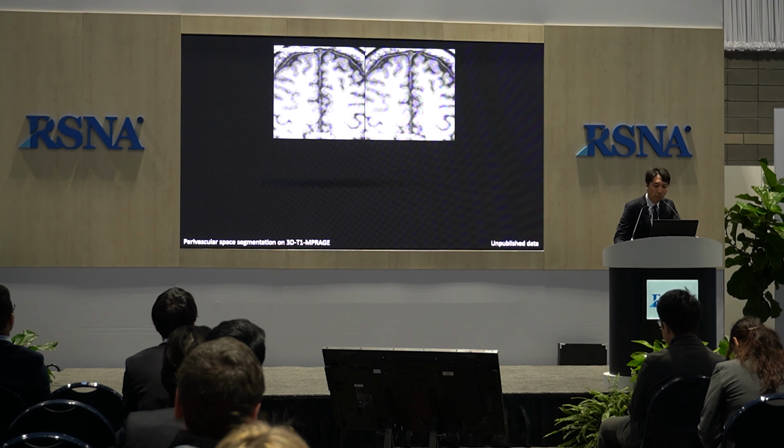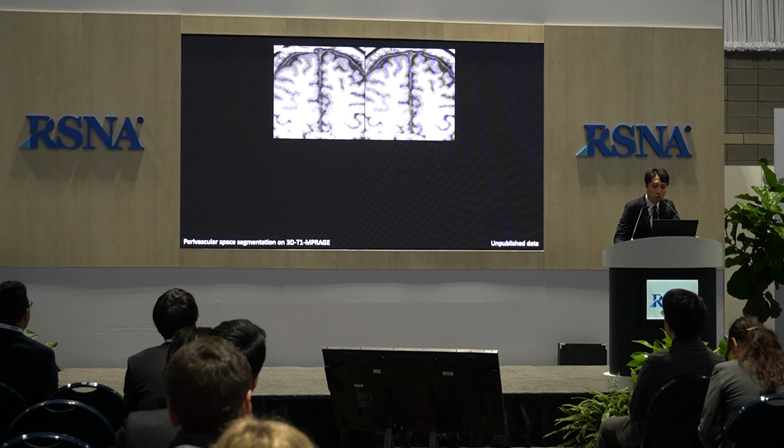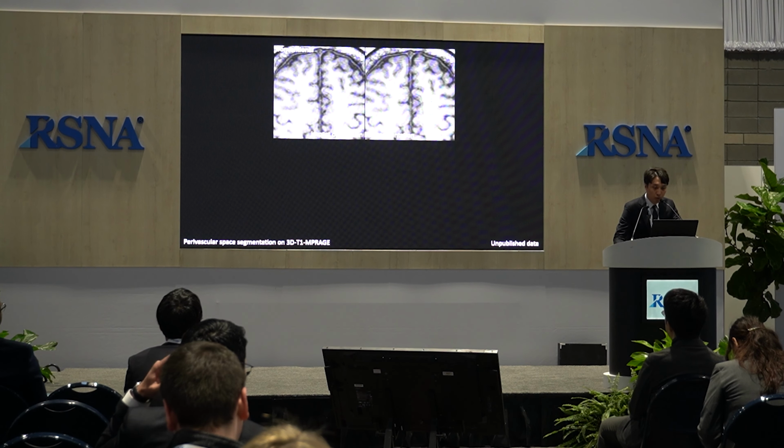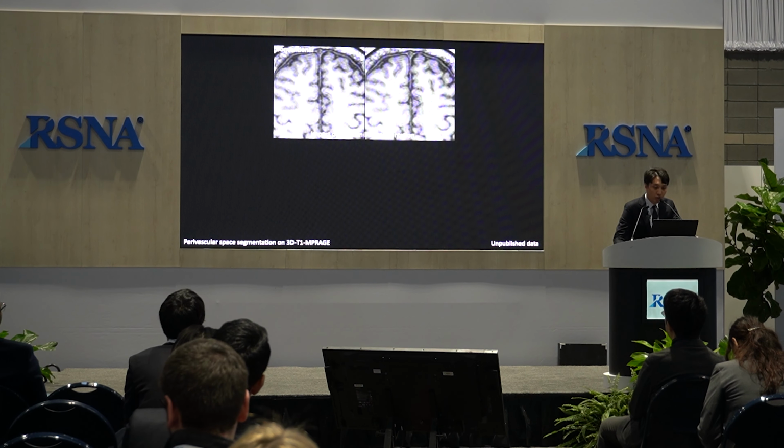These images show the impact of noise on perivascular space segmentation. This is conventional T1 weighted MP-RAGE. The deep learning segmentation model produces these colored dots, which indicate perivascular space. After reconstruction, the noise has improved, and the number of colored dots, the perivascular space, decreased. So, meaning that much of the segmentation was wrongly placed on noise.